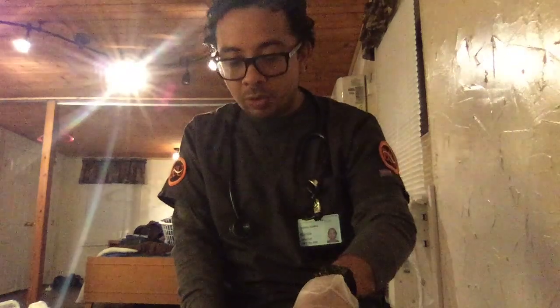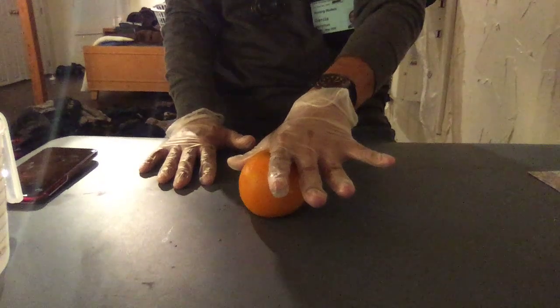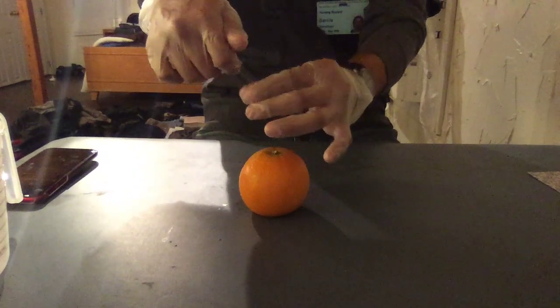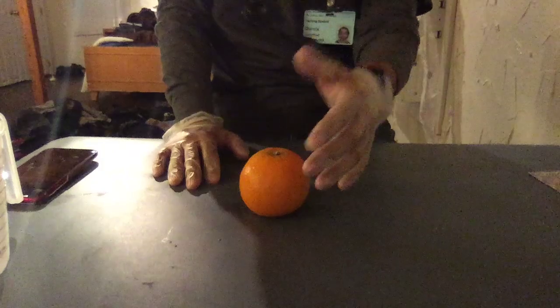For the intramuscular, I forgot to say that when you're doing it, if we're doing the dorsogluteal muscle, I would inject, and I would let go of my non-dominant hand. I would stabilize the needle, and I would inject. That's what I would do for the intramuscular. I forgot to do it.